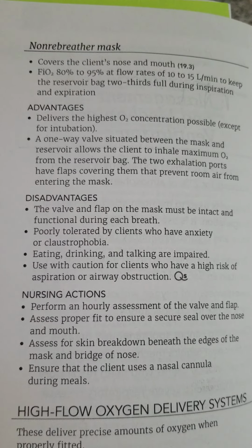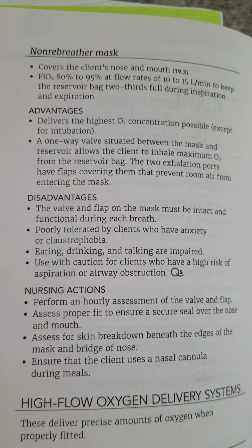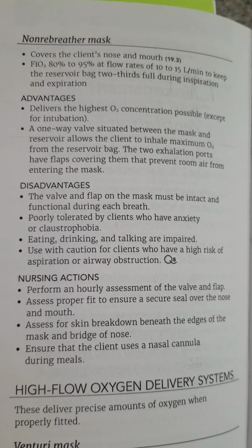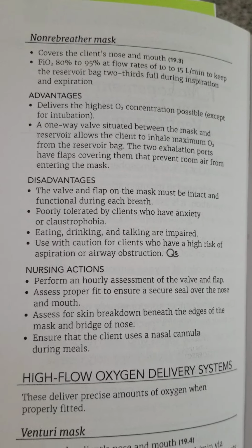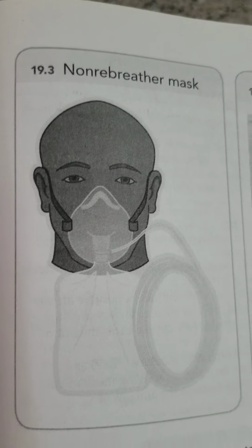A one-way valve situated between the mask and reservoir bag allows the client to inhale maximum O2 from the reservoir bag. The two exhalation ports have flaps covering them that prevent room air from entering the mask. Disadvantages to this non-rebreather mask, which is pictured here.